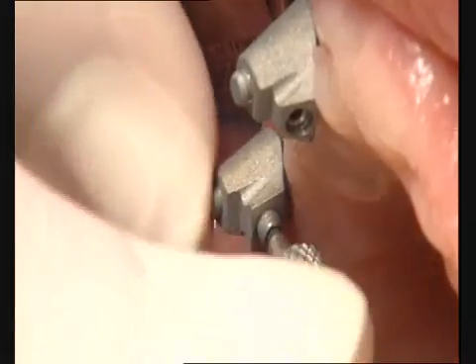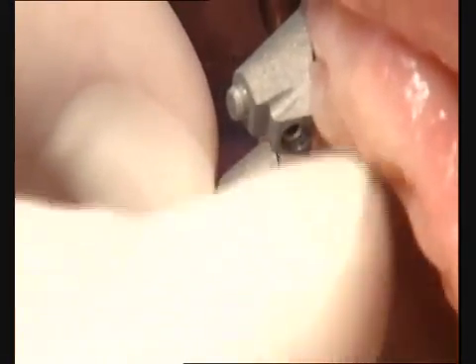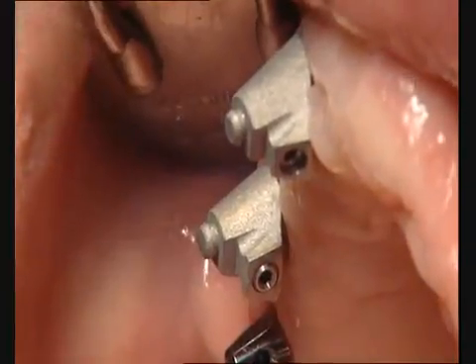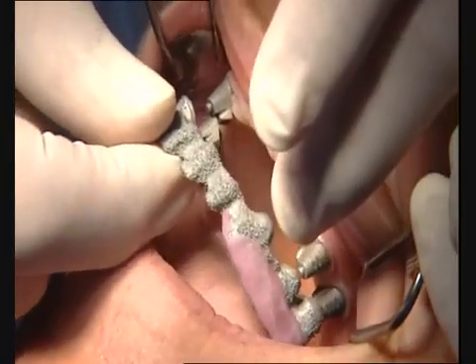The titanium copings are screwed onto the UV-E abutments intra-orally. When fitting the framework, the bonded titanium copings reliably guide the framework into the correct position.